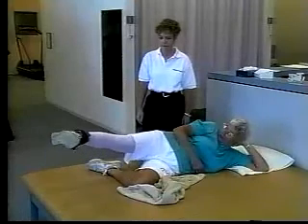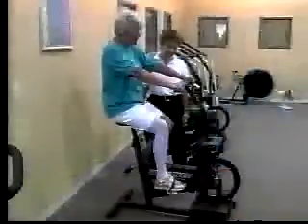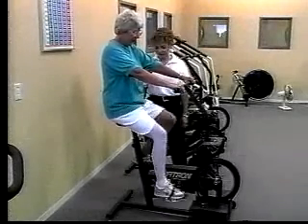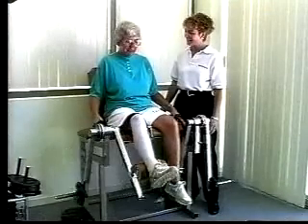Overall results for this procedure are excellent. In the 10 years of follow-up studies, 85 to 90% of all patients are happily functional. Although every case differs, complete recovery from a partial knee replacement procedure takes approximately 2 to 3 months. With a little patience and a little work, you will be back to your favorite leisure activities in no time.